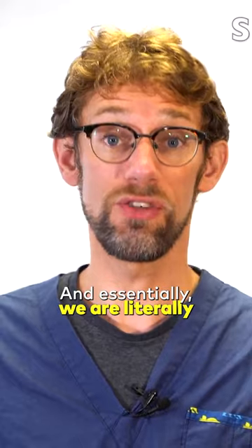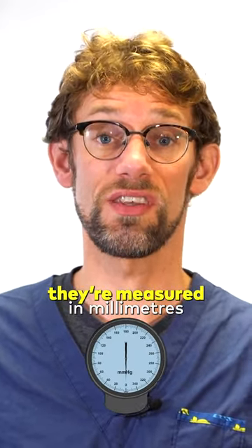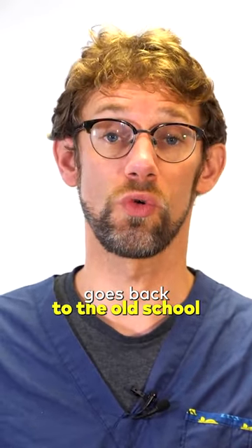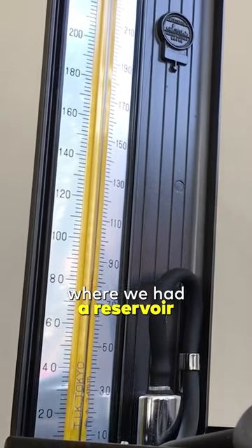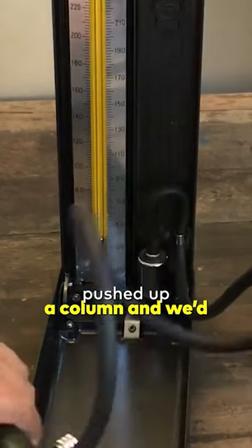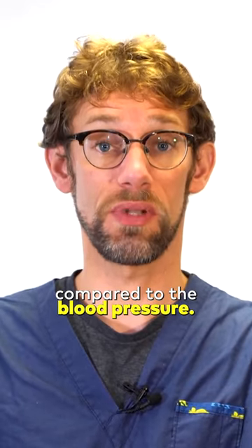And essentially we are truly measuring the pressure, but the numbers that we find are measured in millimeters of mercury. This goes back to the old-school classic sphygmomanometers, where we had a reservoir of mercury that would be pushed up a column, and we'd see how that column height compared to the blood pressure.